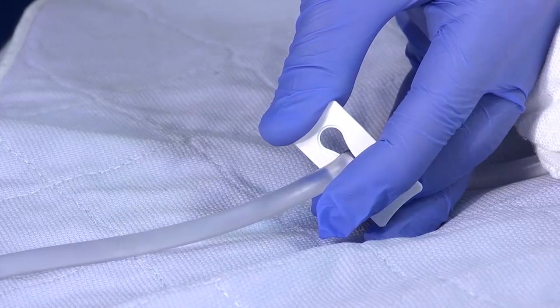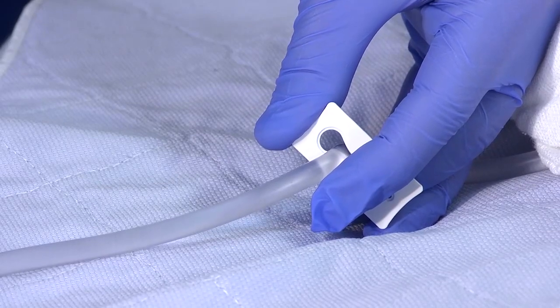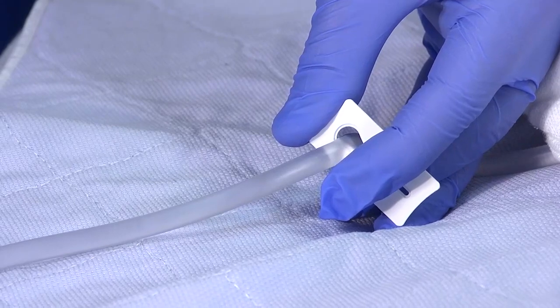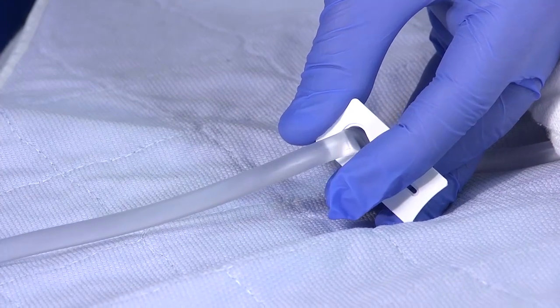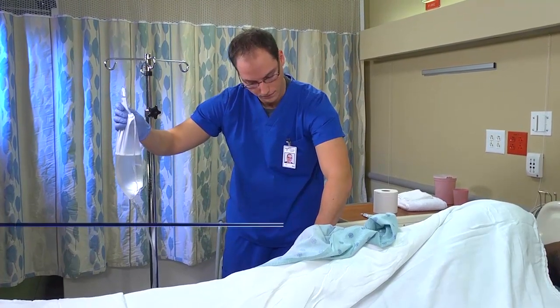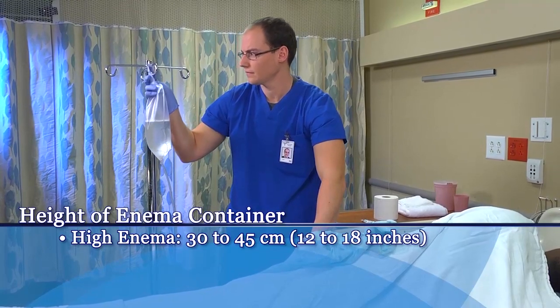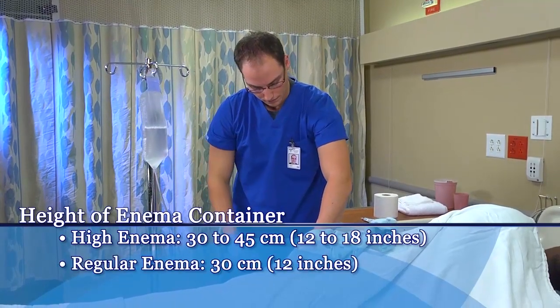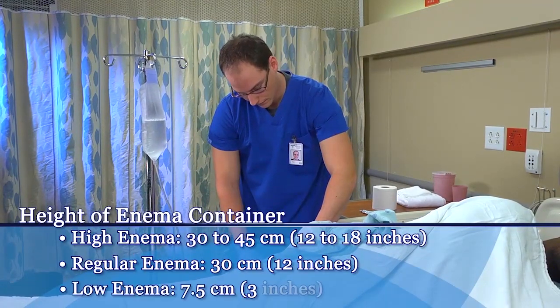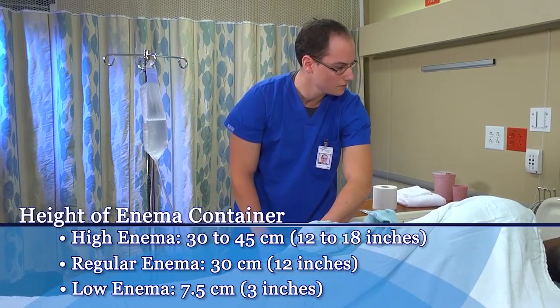As you hold the tube in place, open the regulating clamp and allow the solution to enter. Keep the enema container at the level of the patient's hips to prevent the solution from flowing out of the bag too quickly. Gradually raise the container above the anus. For a high enema, raise it 12 to 18 inches, or 30 to 45 centimeters. For a regular enema, raise it 12 inches, or about 30 centimeters. And for a low enema, raise it 3 inches, or 7.5 centimeters.